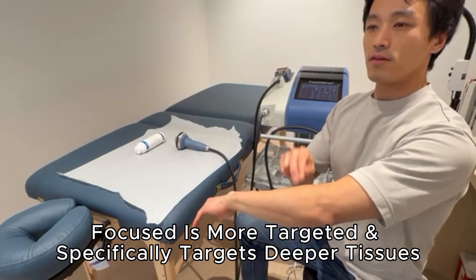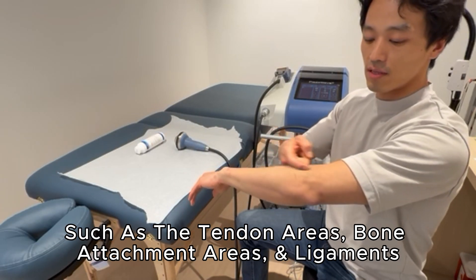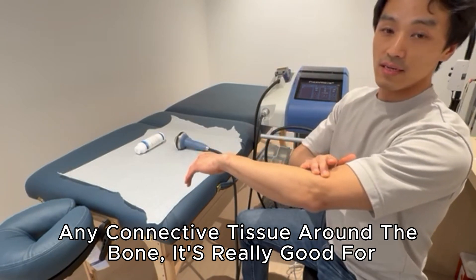Focused shockwave is more specifically targeted around the tendon area, especially the bone attachment and bone insertion area — tendons, ligaments, any connective tissue around the bone. It is really good for those structures.